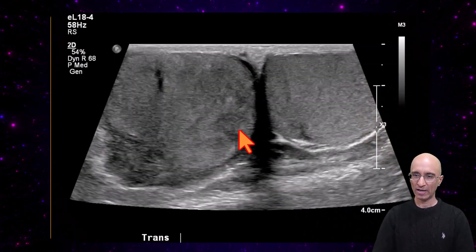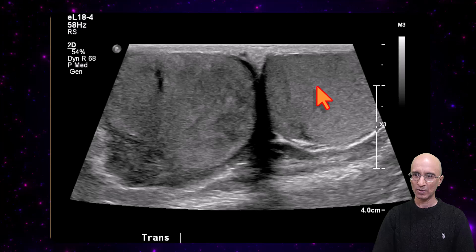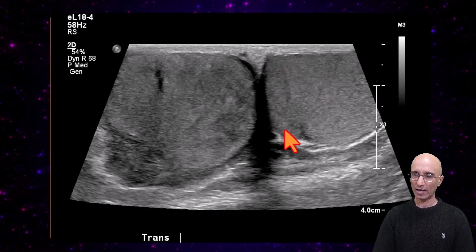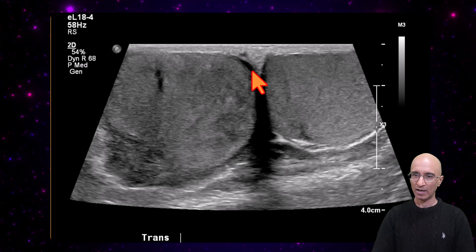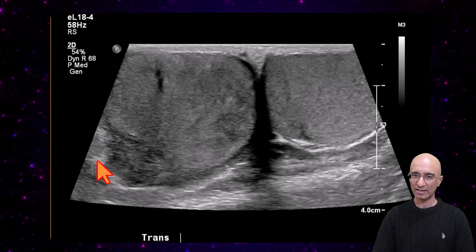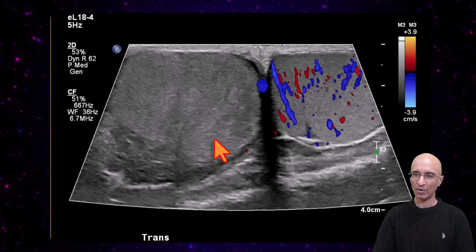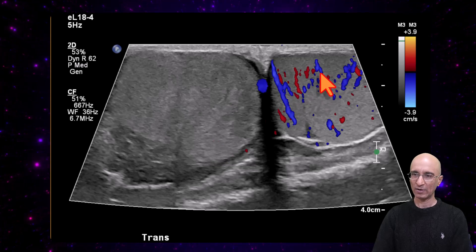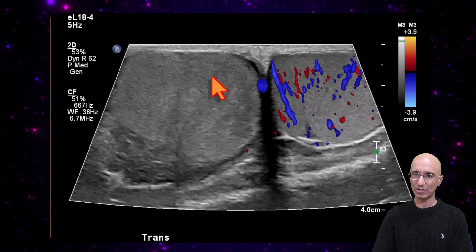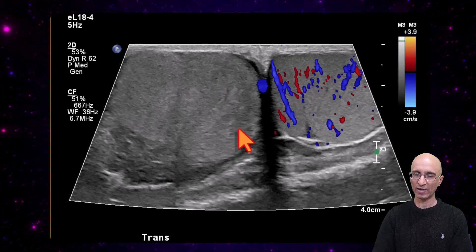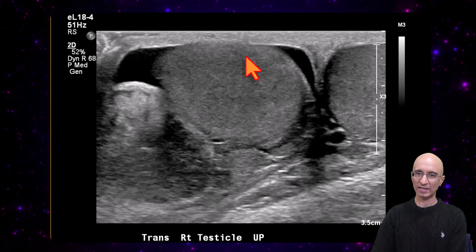On the ultrasound images we have the straddle view, or the buddy view. We have normal appearing left testicular echo texture. On the right side, the testicle is enlarged with heterogeneous echo texture. On the color images, we have normal color Doppler signal on the left side, but no color Doppler signal is identified on the right side. We also have a small right-sided hydrocele.